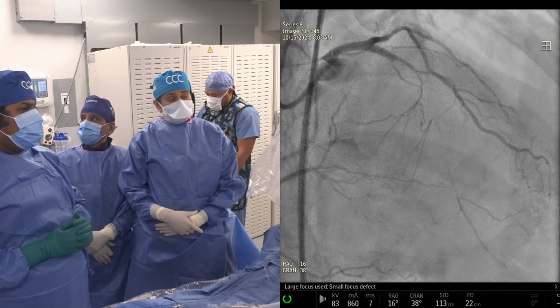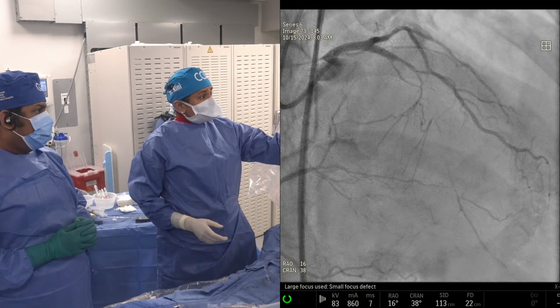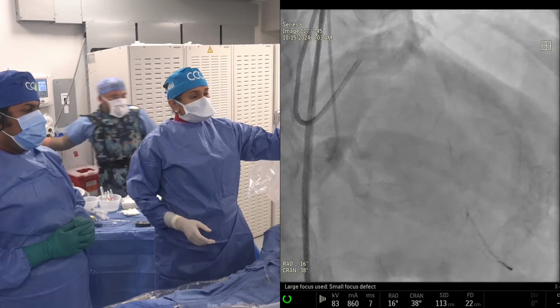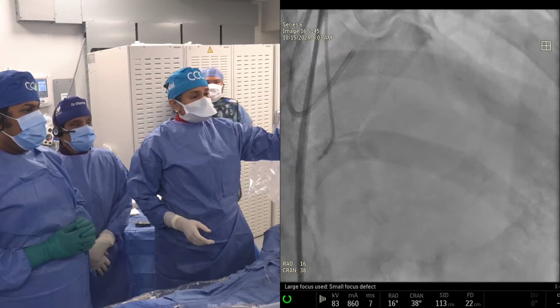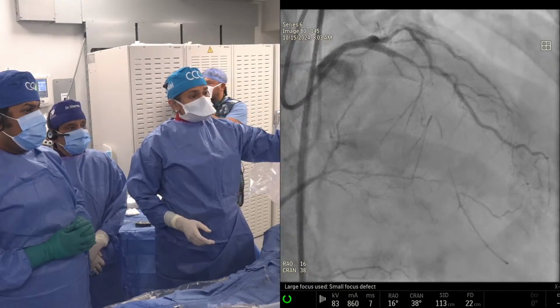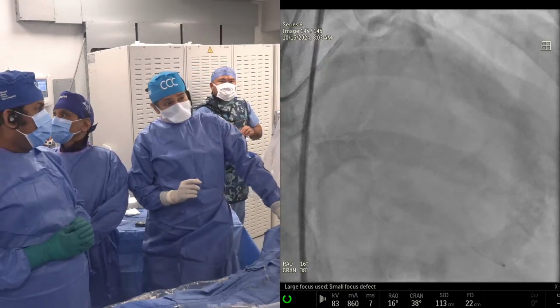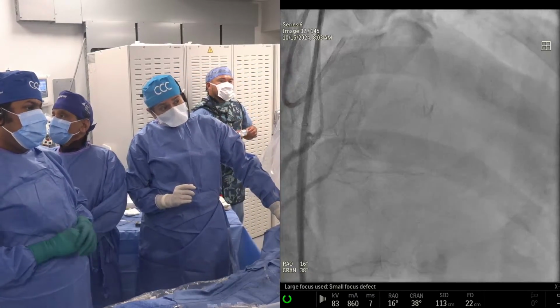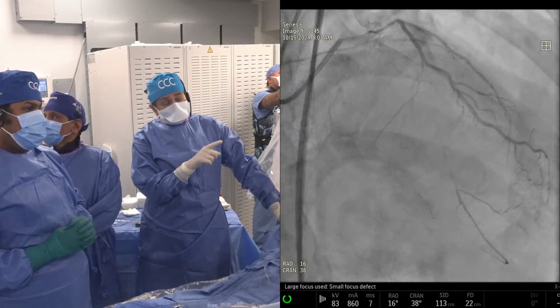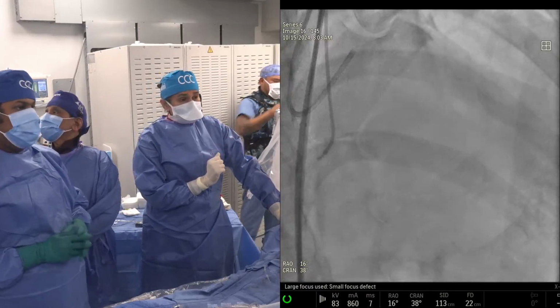Right. Distal LAD was only seen when we did the RCA picture, especially with this, we cannot call it a circle of Vieussens, but since it's not from the conus, but you see it, it's almost, yeah, okay, it is from the conus. Yeah, circle of Vieussens. Which also gives you some suggestion as to the chronicity, no? Yes. So only from the RCA injection we could see the LAD collaterals even in our diagnostic.